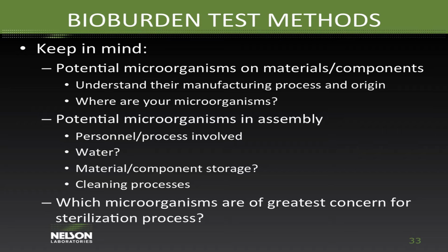We need to understand the origin of all of your materials. And also, where are your microorganisms? Based on the origin, where might the microorganisms be hiding on your product? What potential microorganisms might we find in your assembly process? And so we look at things like personnel and process. We're looking at, is there water involved in the process, either at your location or at one of your suppliers? How are your materials and components stored? And what do your cleaning processes look like?